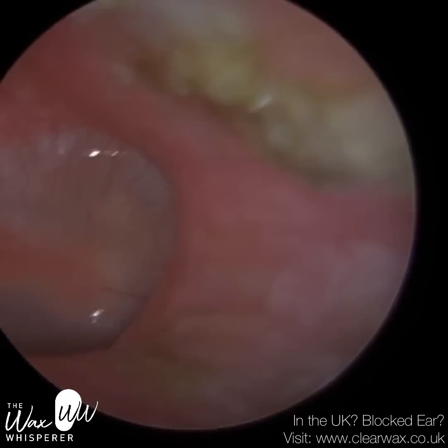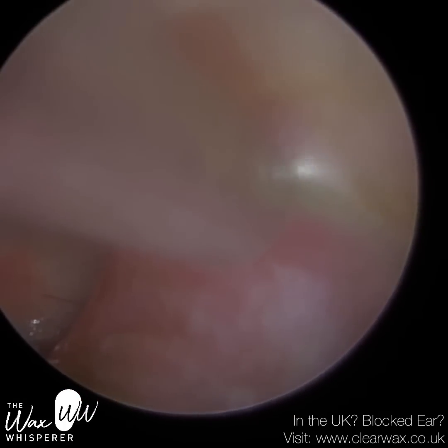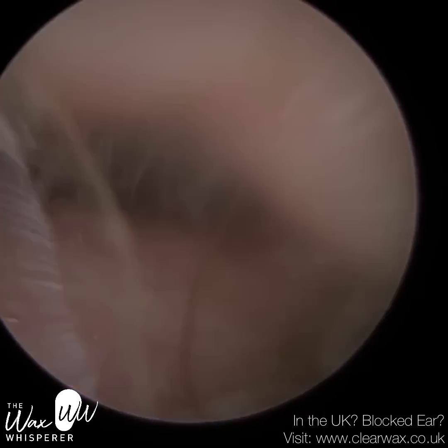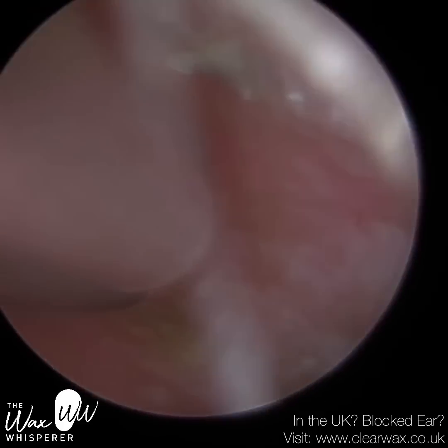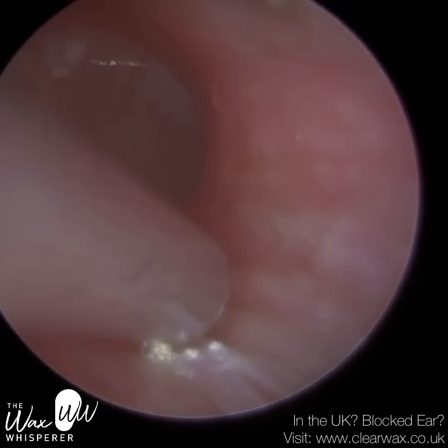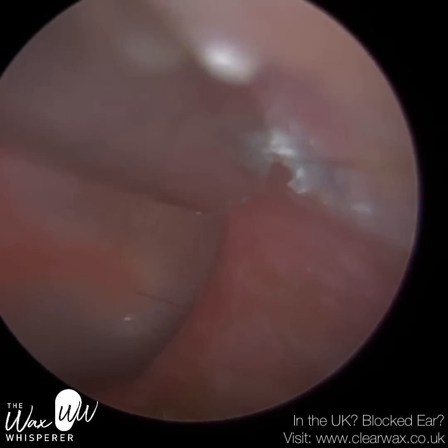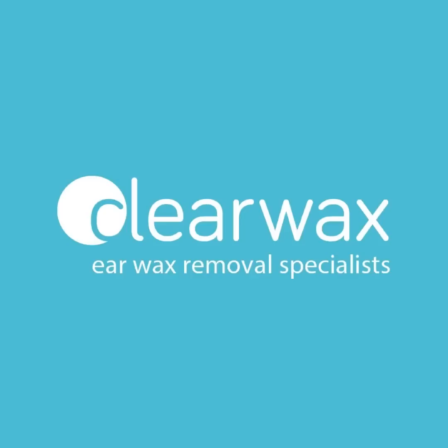I'm going back to the ear canal — there's a bit of dead skin here, and I'm going to try to remove as much as I can from the floor as well. As I entered the ear it's quite narrow, but once you're in it does widen. The hairs at the entrance are a bit oily and wet because of the drops, so I've come back out with the endoscope to wipe the tip and remove any excess. When I went back in, I wanted to avoid any of the hair strands so it doesn't smear. The skin that remained wasn't fully coming out, but it has more of a chance of migrating than the skin that was on the eardrum. And that's the patient's eardrum — nice and healthy. You've got a brand new eardrum, brand new ear canal. I hope you enjoyed that video — do stay tuned, I've got loads more videos to upload. Take care, keep well, be nice and be kind.